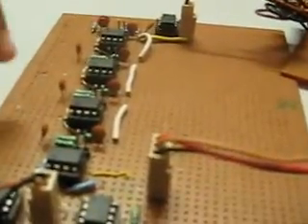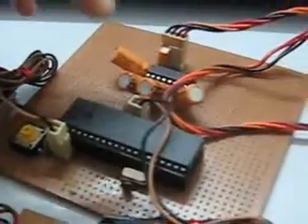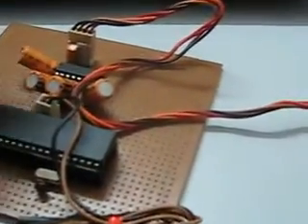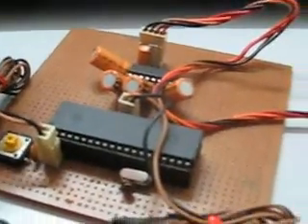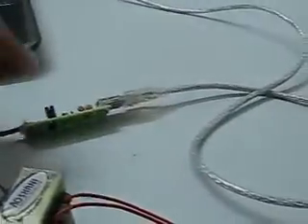Then for a clear view of the ECG signal, we have to make the filters. So we have designed a 6th order Butterworth filter and a notch filter. Through this, we are transferring the signal to the 18F4550 microcontroller, in which the analog signal is converted into a digital signal, and then through serial communication we are transferring the signal to the MAX232. We had taken the 18F4550 for USB purposes, but it is not working in our project, so we have used it for serial communication, and then we have used a serial to USB converter and transfer the signal to a computer using this circuit.